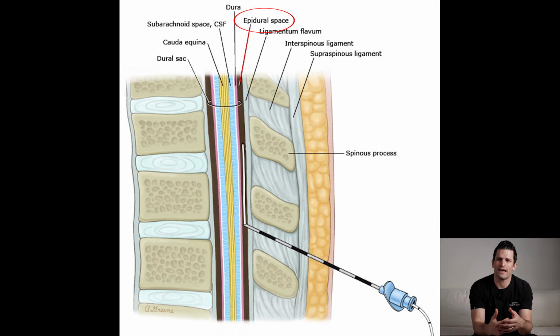If you think about a woman having labor and the anesthesiologist does an epidural, they're injecting medication into the epidural space. This is kind of like that, only they're putting in a needle and a wire into the epidural space that delivers electricity to the spinal cord. The patient will respond to the spinal cord stimulator as to whether or not they feel the stimulation and if it's covering the area of the pain during the trial. And it's important to communicate with the team in the room during the trial so that they can identify where the optimal place is for the electrode placement.